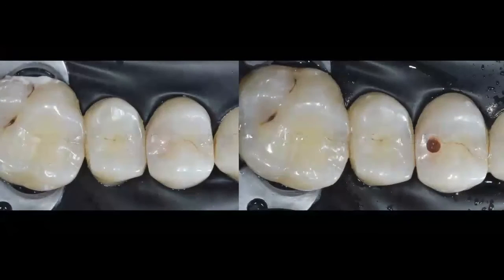Now, as you know, once we have our patient numb, we have isolation, and we are ready to access our caries lesion, the first thing we want to think about is to try to avoid damaging the neighboring tooth. If we have a class 2 situation like the one I'm sharing with you here in this first premolar, we have to make sure that when we access that lesion, we do not impose any damage.